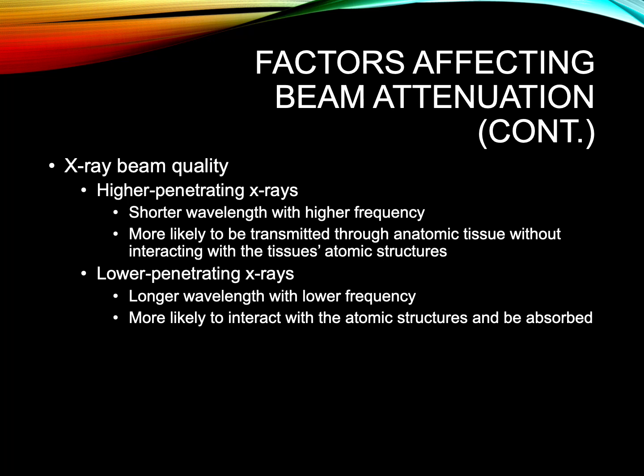All right, so I'm talking about X-ray beam quality. The quality of the X-ray beam, or its penetrating ability, is going to affect its interaction with anatomic tissue. Higher penetrating X-rays, which have a shorter wavelength with higher frequency, are more likely to be transmitted through anatomic tissue without interacting with the tissue's atomic structures.